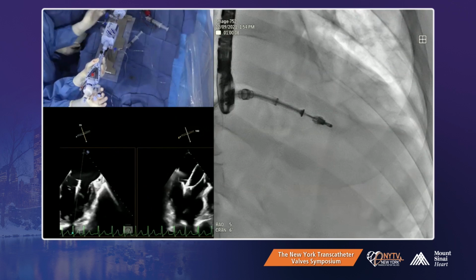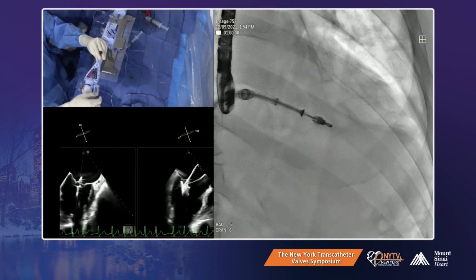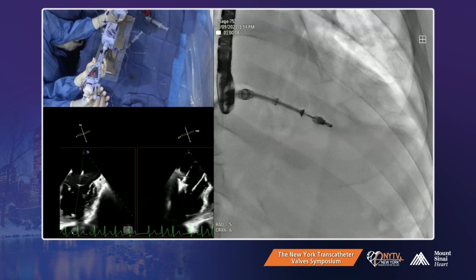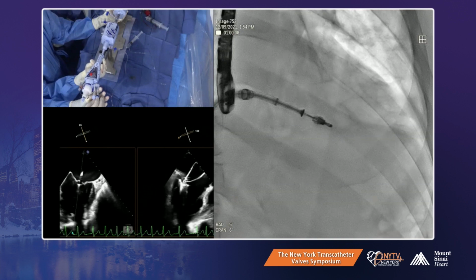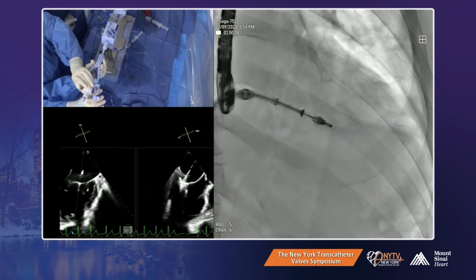Do we have enough? Not much. Not enough. But we can get this and try to go posterior. Left. You need just enough diastolic time to let it rest so you can actually drop it.